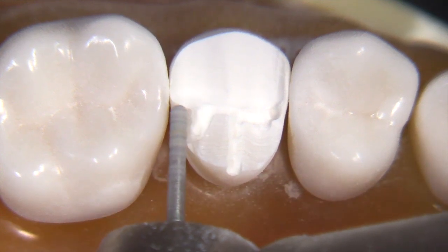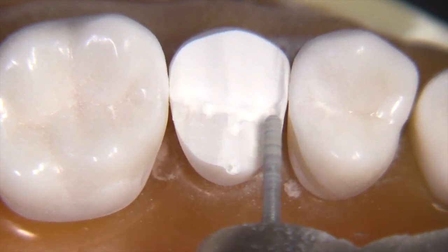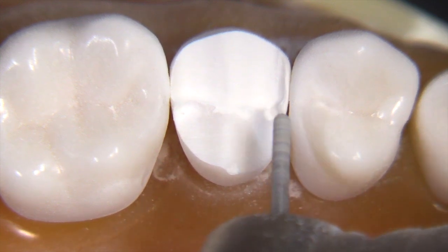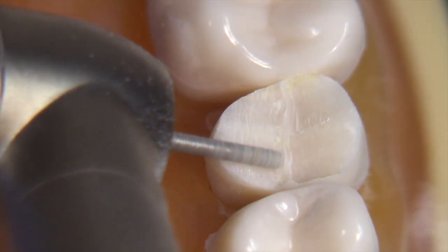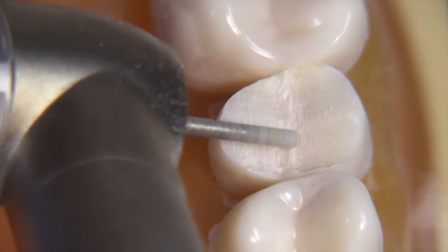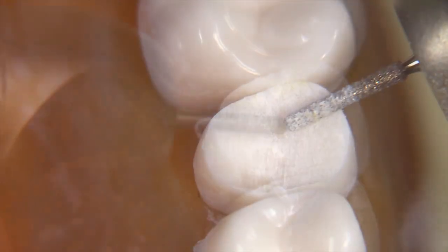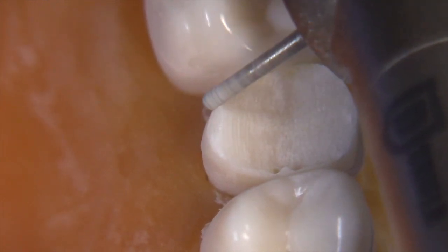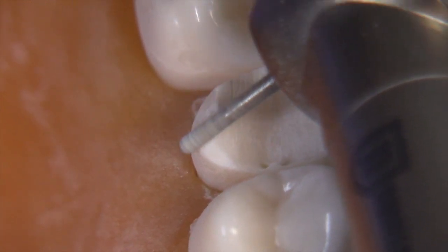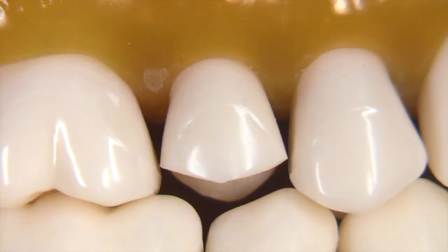Emax requires 1.5 to 2 millimeters of thickness on the occlusal — that's if you're in dentin. If you're in enamel and have the opportunity to perform a super conservative preparation — perhaps opening up the vertical dimension and adding tooth structure via Emax on top of existing enamel — then you really don't have to reduce very much at all. The Emax can be less than 1.5 millimeters because it's bonded to enamel. But that situation doesn't happen very often. Typically when doing an all-ceramic crown, we have significant wear or tooth structure destroyed through caries or existing restorations.